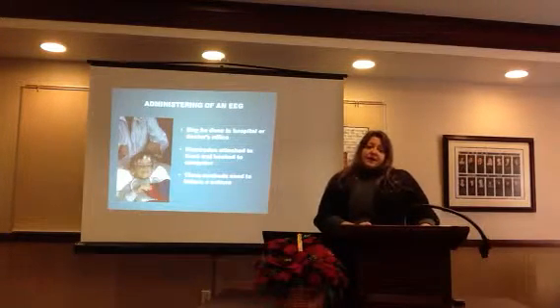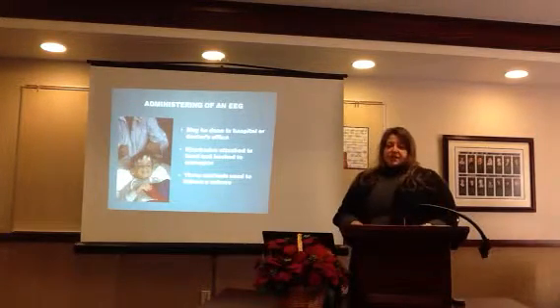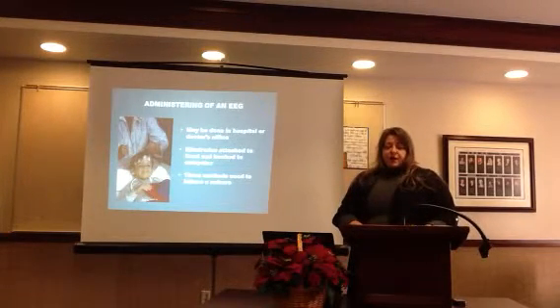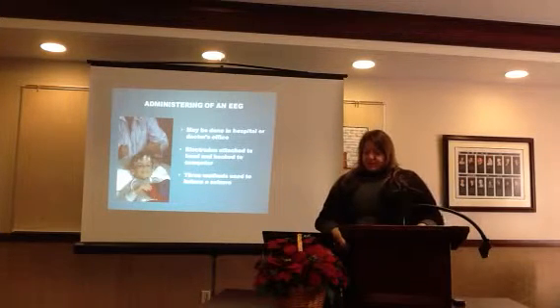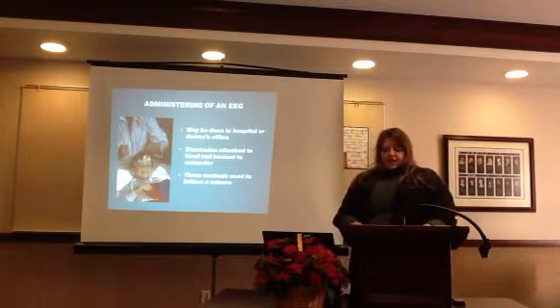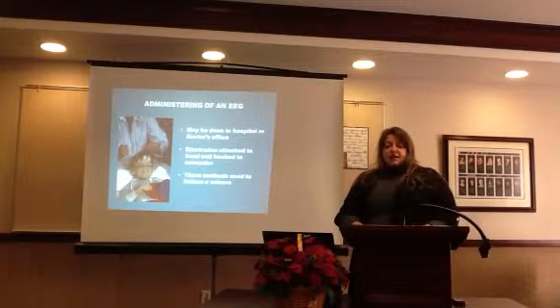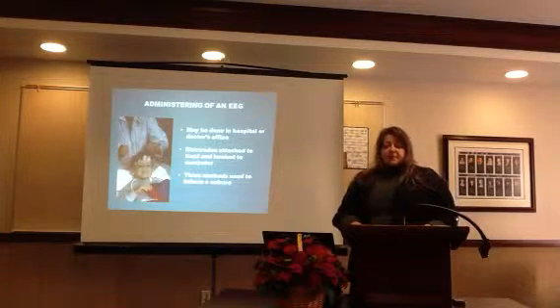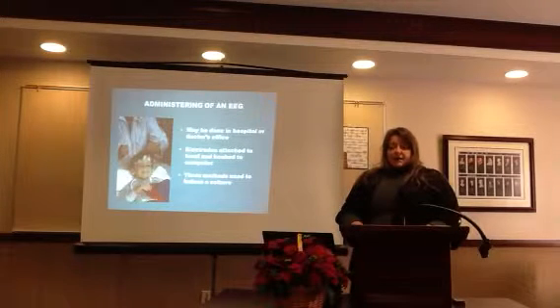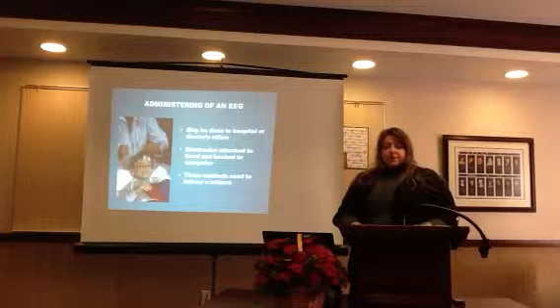In the case of a sleep-deprived EEG, the patient would be asked to stay awake through the night prior to arriving at their appointment. When the patient arrives at the EEG, the technologist will situate the patient in a bed or in a recliner. This allows the technologist to have easier access to the top of the patient's head. The technologist will apply the electrodes that go from the patient's head to the computer.